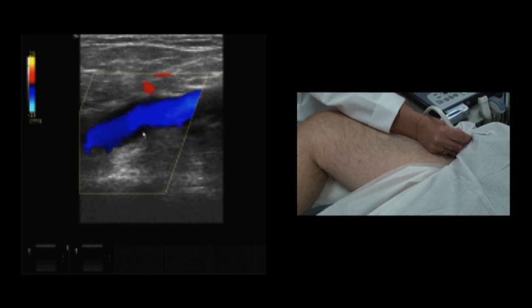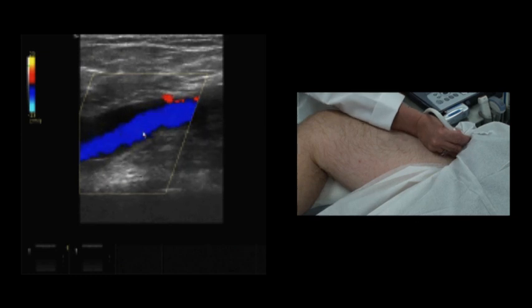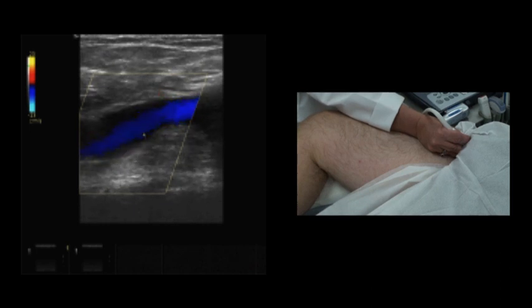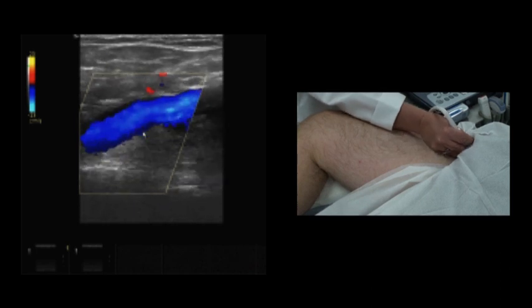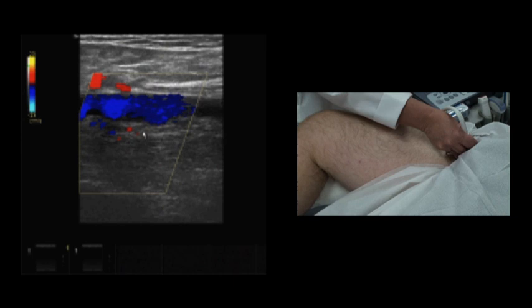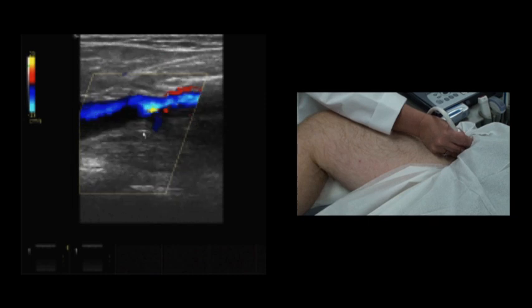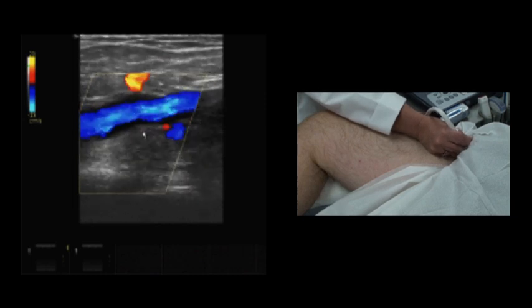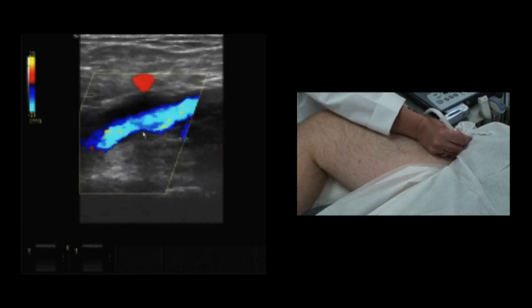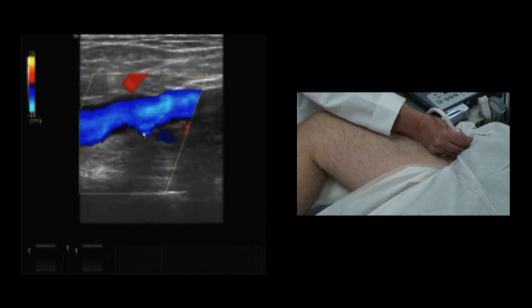We're in a longitudinal orientation at the level of the common femoral vein and artery. We now see the common femoral vein. It's very important to have an angle on the vessel, and I call this a heel toe. If you aim a little superiorly with the transducer, and it's kind of a rocking, you can see if you're laying completely against the skin, the color is not filling well. So if you scan and just rock the transducer in a heel toe, you get very good color filling within this movement. Okay, and we want to take a look at the color. Is it filling the vessel? Is it moving with the respiration?